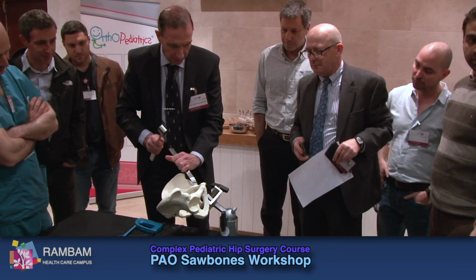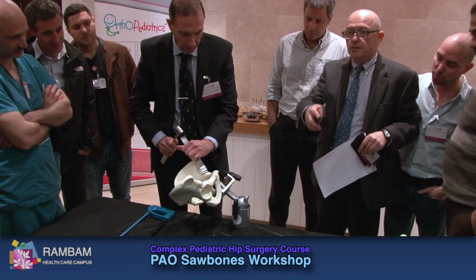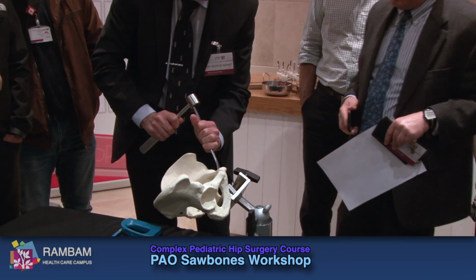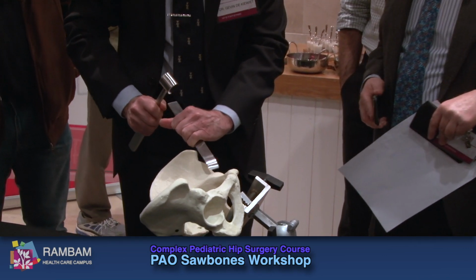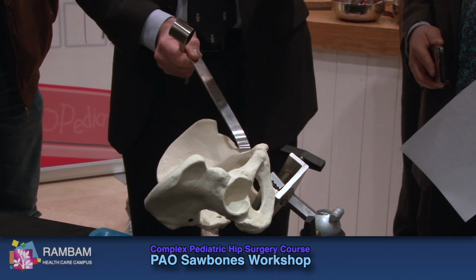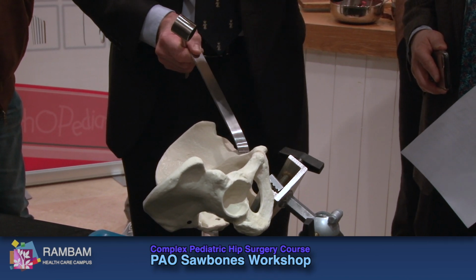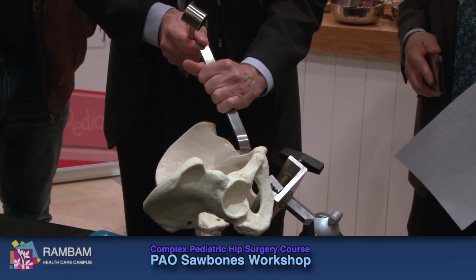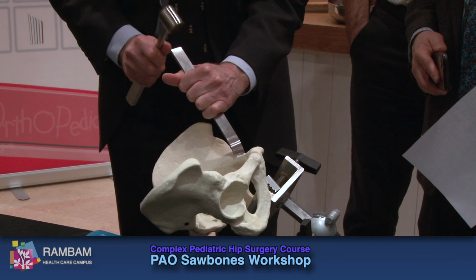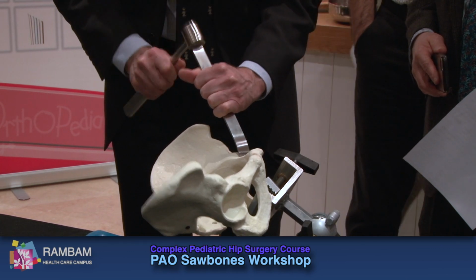So I start off by doing a little bit of subperiosteal, subcortical, like a Judet elevator, right? Until I get to the right spot. And that's because it lifts up the bone cuts like that, you're more likely to get good bone healing, right? And then you take your osteotome perpendicular to that, with a slight angle. And in that direction.